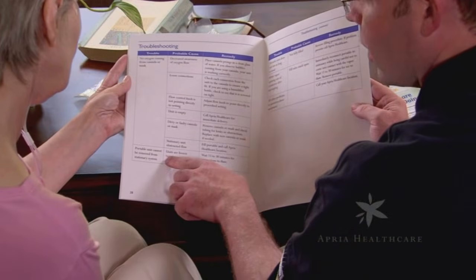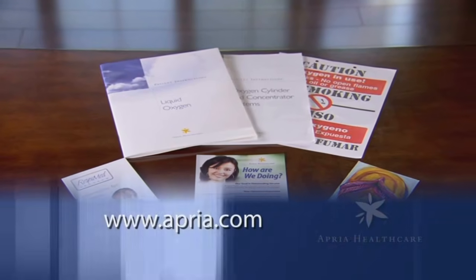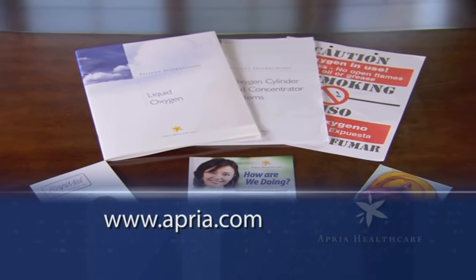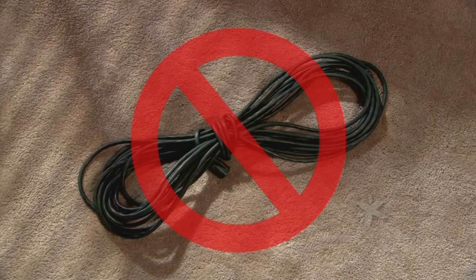Please refer to the patient instruction booklet for a detailed guide or the manufacturer's product or operating manuals, which can also be viewed online at www.apria.com. If an equipment failure occurs, you should check for the following potential problems. Make sure the unit is not connected to an extension cord. Extension cords should never be used to power the unit.